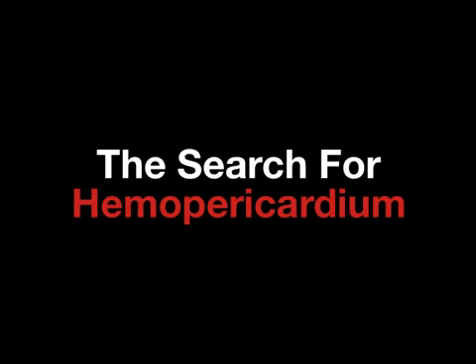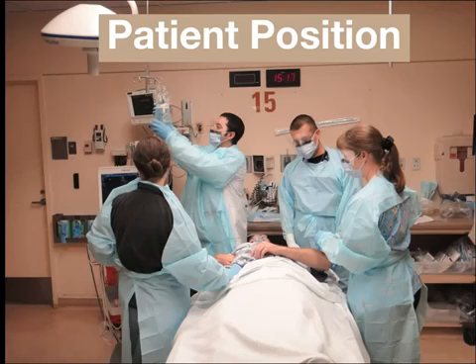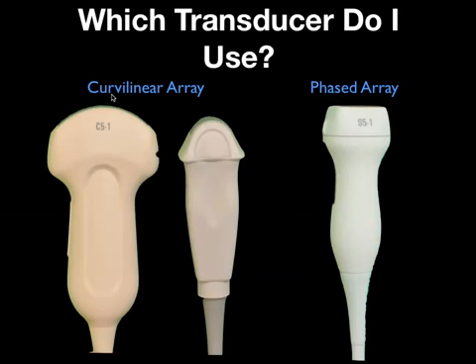So let's begin our journey with the search for hemopericardium. We're going to begin by helping you gain an understanding of the subcostal window. In terms of patient positioning, the exam should be performed with the patient in the supine position. In terms of which transducer to use, any of these transducers would work.